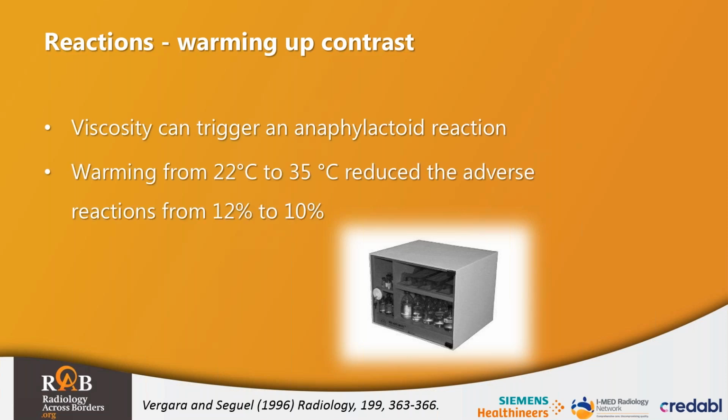So we've already spoken about warming up contrast to reduce the viscosity of the material. It also reduces the risk of an adverse reaction to the contrast. By warming up the contrast, we can reduce the potential for an anaphylactoid reaction by 2%. And as such, it's become the gold standard in many imaging departments around the world.